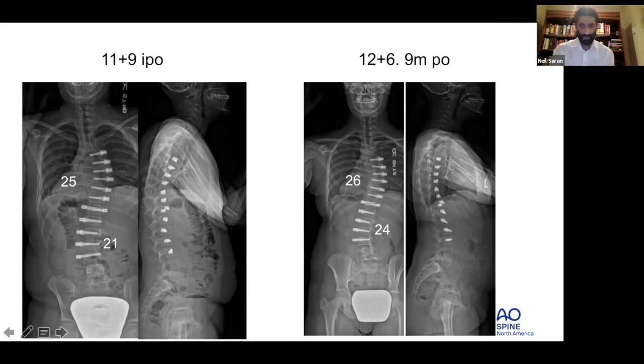And interestingly, you see, quickly? People were asking what happens with the kyphosis and the lordosis. See how, as you corrected your lumbar spine in the coronal plane, you increased lordosis, and similar for the thoracic spine. It's starting to have more kyphosis, but it's also the correction. So it's starting to move. As you start having your vertebra rotating like this, there's a coupling effect between the coronal plane and the sagittal plane. And that's what's happening.